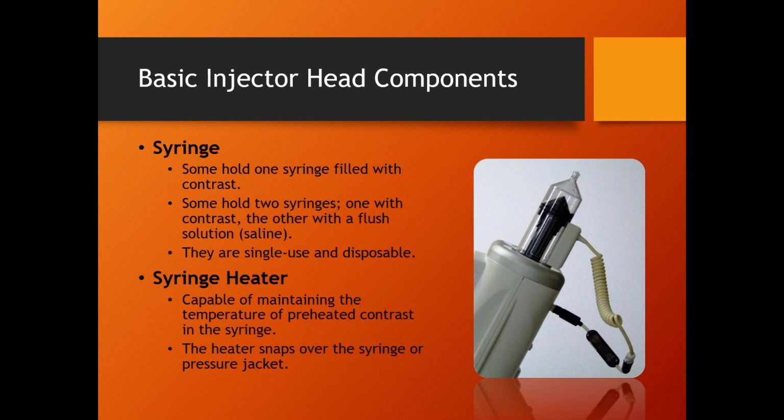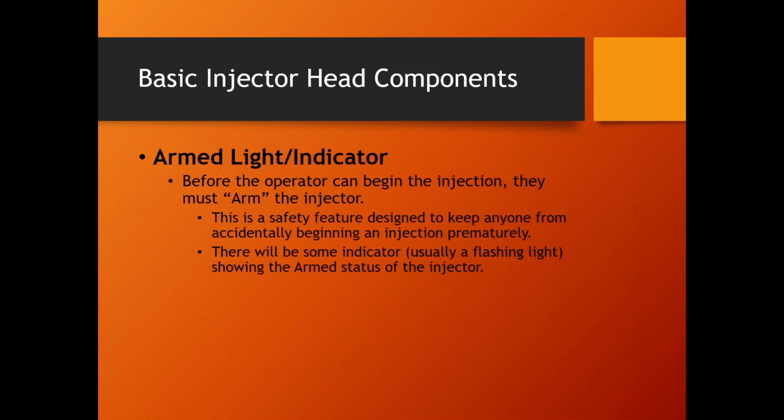Now, the manufacturer is no longer liable if they kill a patient with an air bubble because they said they did it. All right, so we brought all this on. The armed indicator light. These right here, these are your visuals. These are the visuals to the operators. We're armed and we're ready to go.